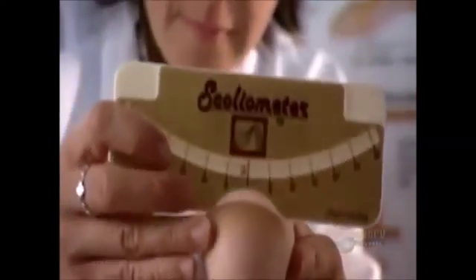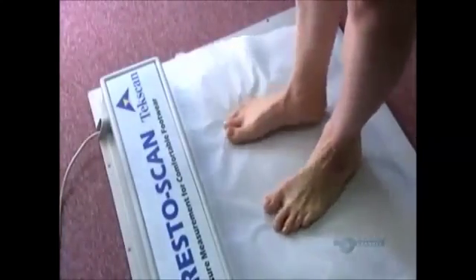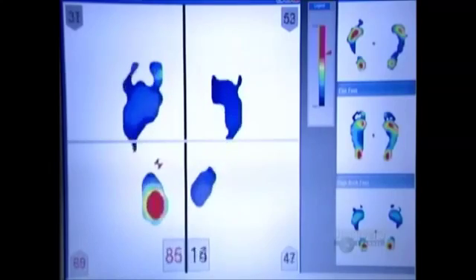Then, it's on to specialized devices that analyze foot position and movement during standing and walking, and how body weight is distributed onto the feet. In this scan, the red areas show that more weight is landing on the left foot than on the right.